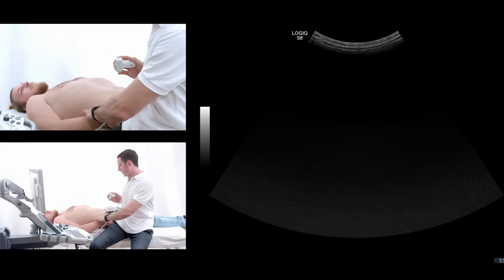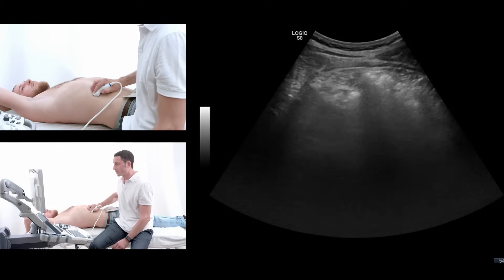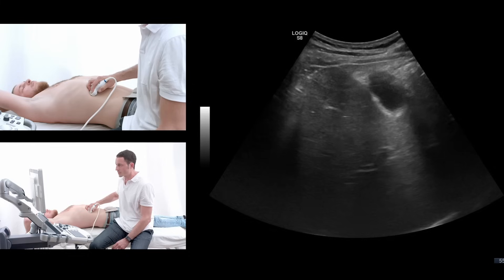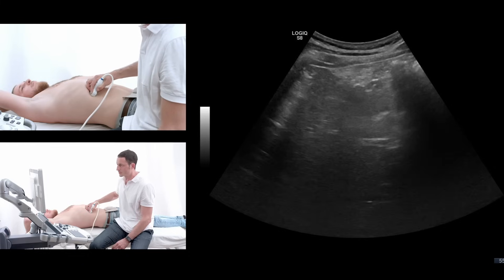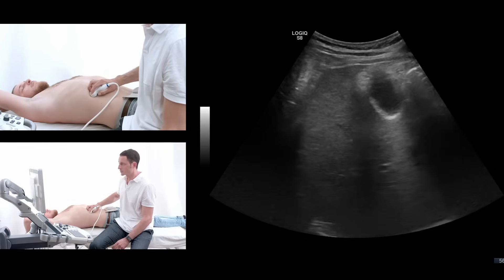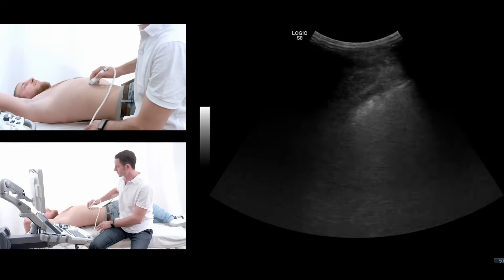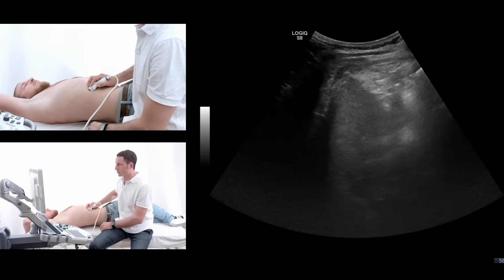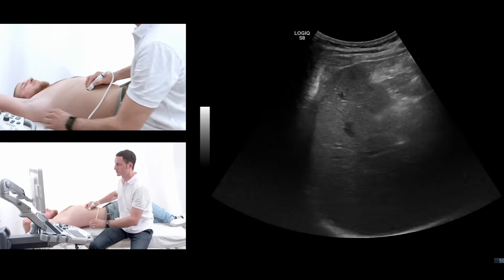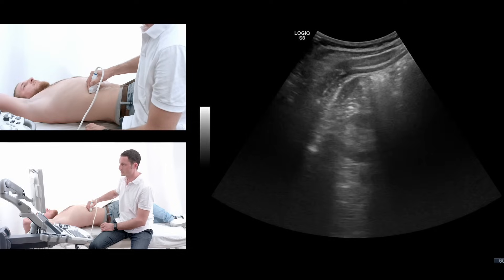You can also put the right arm over your head. Take a deep breath again. And here you can see the picture getting a little bit better, but still it's not optimal. Can you turn around to the left side a little bit? Take a deep breath again. Now we can see the right liver lobe a little bit better.